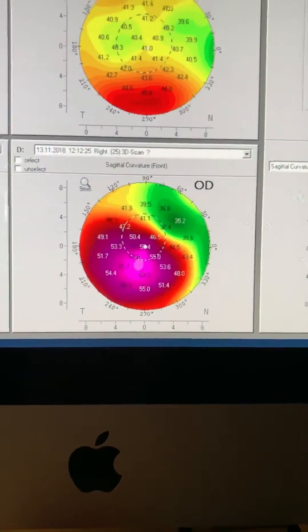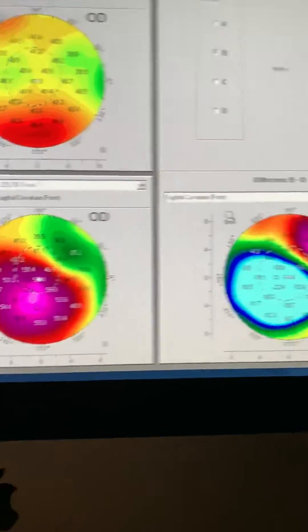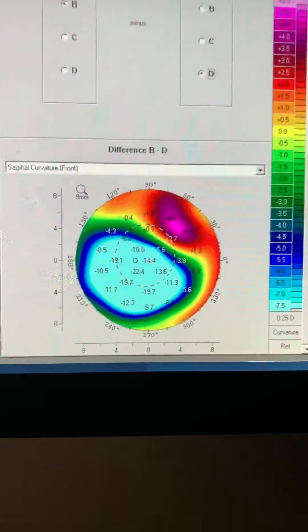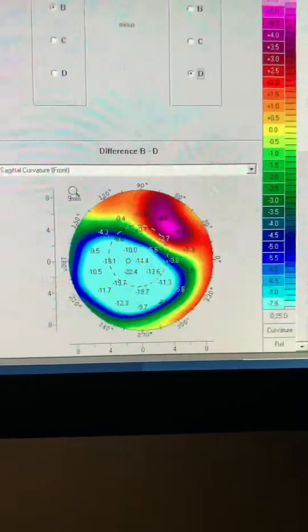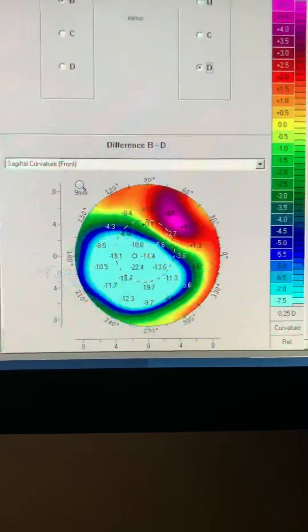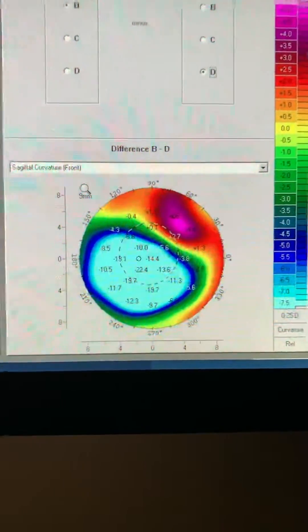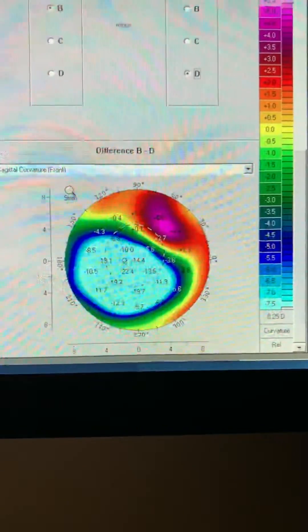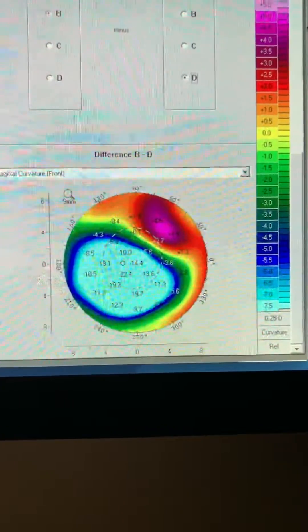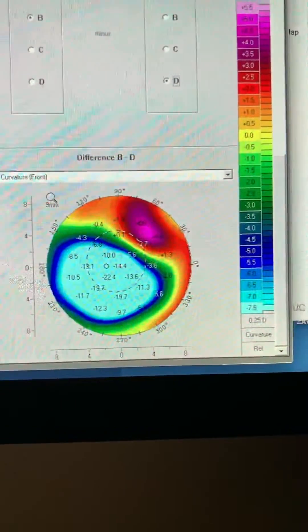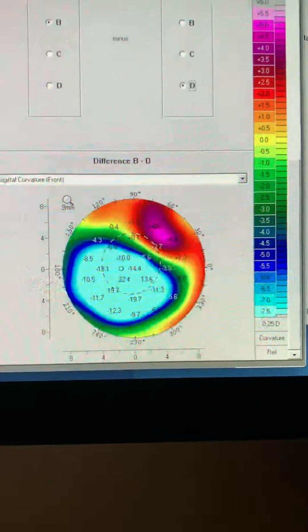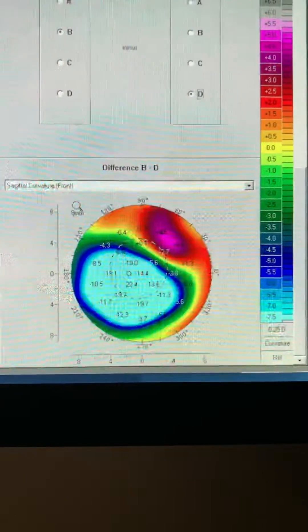Surprisingly, the other eye shows no significant change. And this is the change, 22 microns change in posterior float.